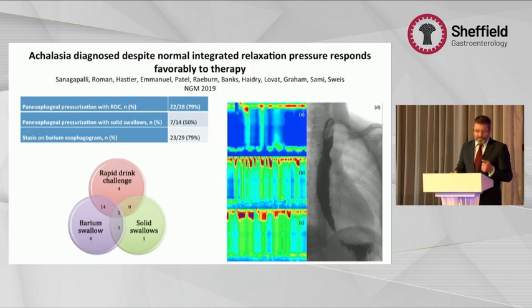We've published this just last year, looking at a cohort of patients with aperistalsis but no obstruction on small volume water swallows. 80% of them had obstruction defined by giving just a glass of water to drink freely. And you can see that the obstruction suddenly appears. And these patients had achalasia, went on and had therapy, and the results are exactly as good as standard achalasics.